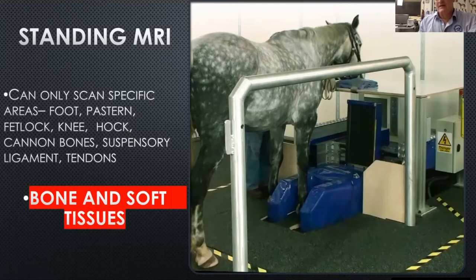We've had cases where we've had a horse in there for a couple of hours, the horse gets sick of it, we take it out, we might bring it back later that afternoon, and even bring it back the next morning to finish off a couple of views if we've got a really difficult horse. But that's rare. Because you're in that small, confined area — much smaller than the bone scan room — we have to be a little bit more conscious of when they get sick of what they're doing.